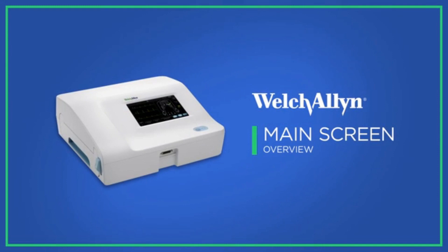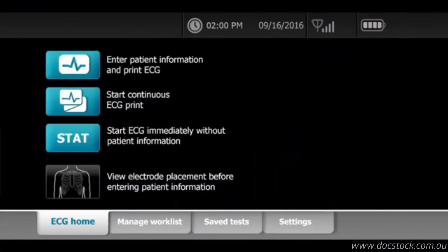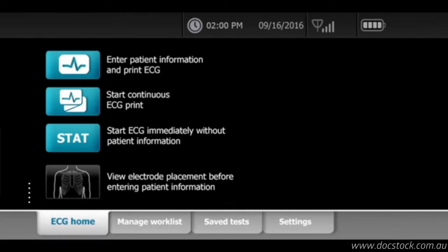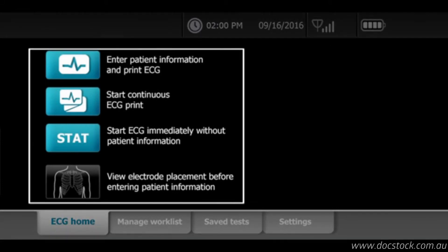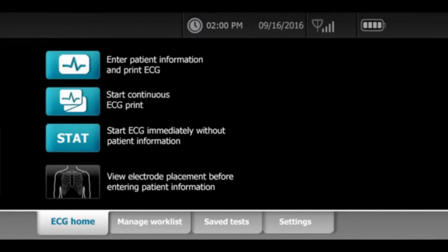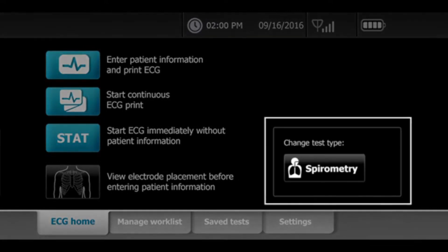The main screen of the CP150 is divided into three areas. At the top, the device status displays patient information, connectivity status, messages, and more. The content area in the middle displays buttons to initiate various ECG test types. At the bottom, you'll see a tab-based navigation area.